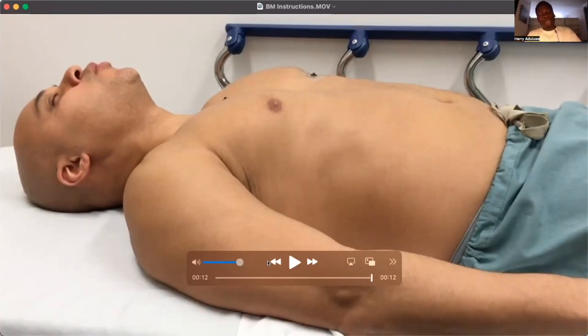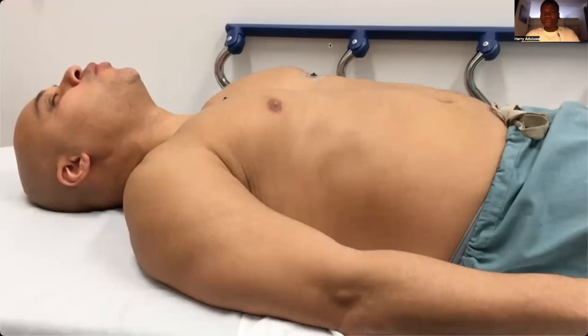In the first 1 minute of the 4 minutes of this sequence, the patient breathes normally, without a metronome, just normal breathing. Tell the patient to take their time breathing. The next 2 minutes of the sequence, the patient breathes with deep inspiration, deep expiration, deep inspiration, deep expiration.